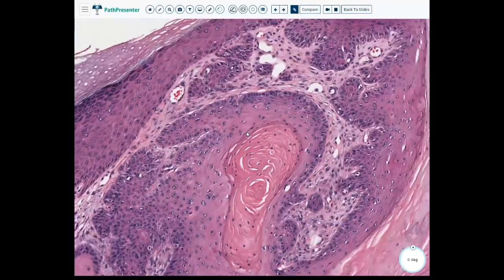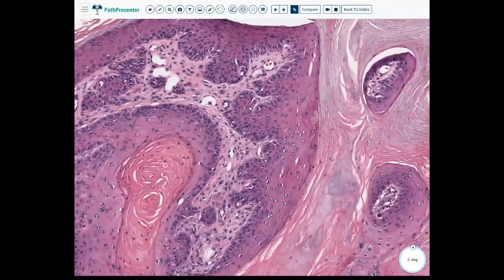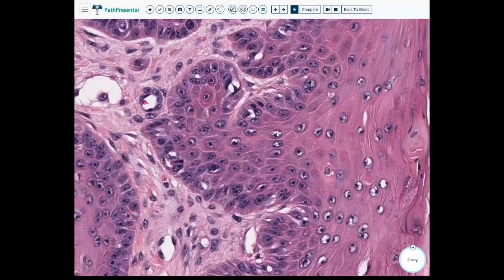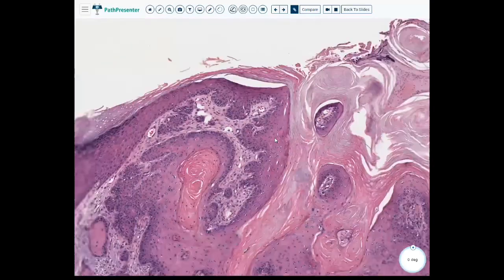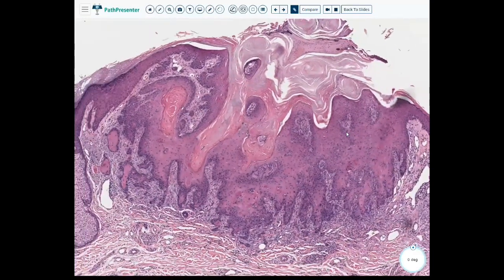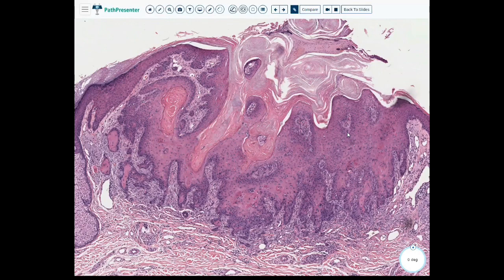I wish some of the features were a little more prominent, but these are nice examples to go over because differentiating this from a true invasive squamous is important. In invasive squamous, we want surgical excision versus keratoacanthoma, where a lot of these will spontaneously regress — huge differences in what you really want to do surgically for the patient. So you want to be sure: keratoacanthoma versus squamous cell carcinoma. This is a keratoacanthoma.